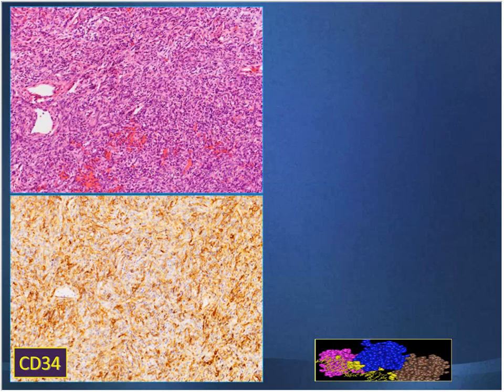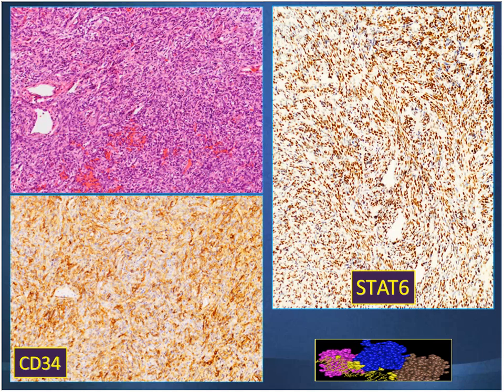Here is an example of a solitary fibrous tumor of the orbit. Our old immunohistochemical stain for that particular tumor was CD34, which is universally positive. Now with STAT6, you can see a nice nuclear staining of almost all the cells in this tumor, confirming that diagnostic entity.